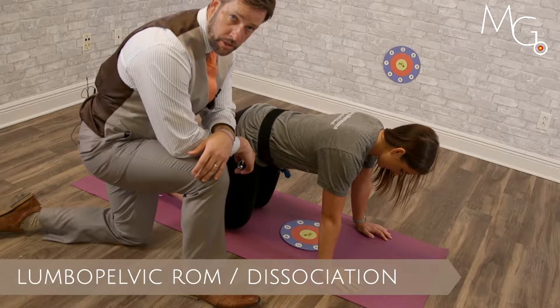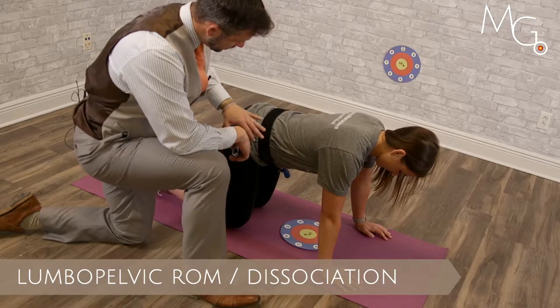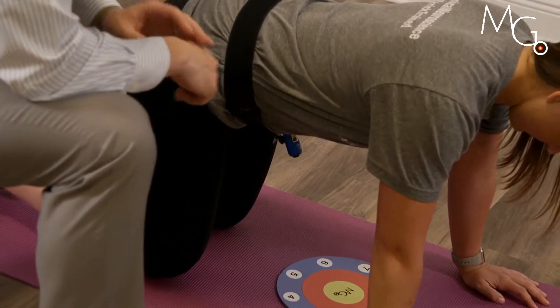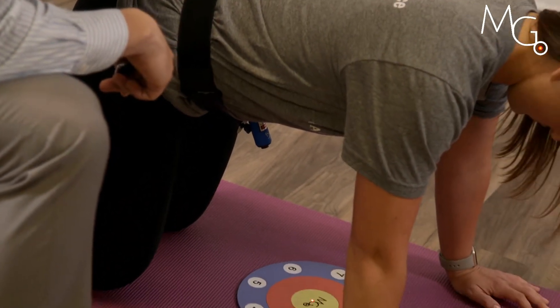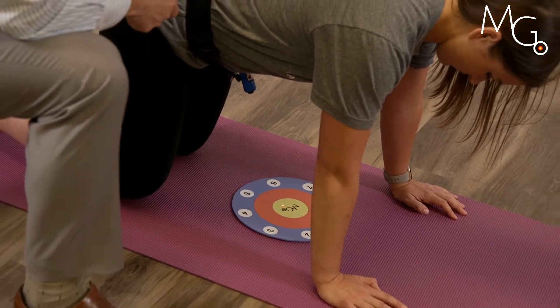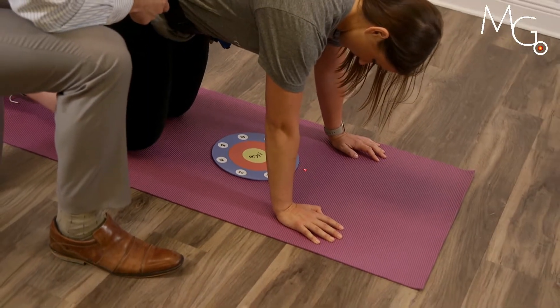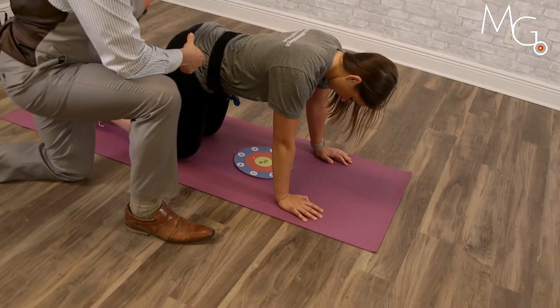Using the motion guidance product to investigate lumbopelvic dissociative movement can be assessed by using the large belt around the ASIS of the patient with the perpendicular mount. You can turn the laser on, have the patient center up on the target, and then do lumbopelvic tilts into flexion, and back down to the center, and into extension to the bottom of the target.